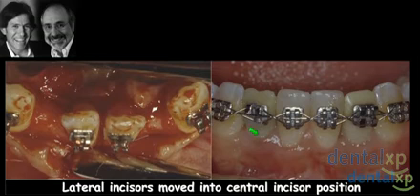I think this is really what Dennis highlighted. You've got the adjacent teeth here to support the papillae, and then what you actually said is these are 2 different diseases. The interproximal and the buccal are 2 separate issues. We've really kind of eliminated the interproximal by having the adjacent tooth there. Now we're only having to deal with the buccal aspects of it. So you've got 2 implants still, but 2 separated implants, not adjacent.